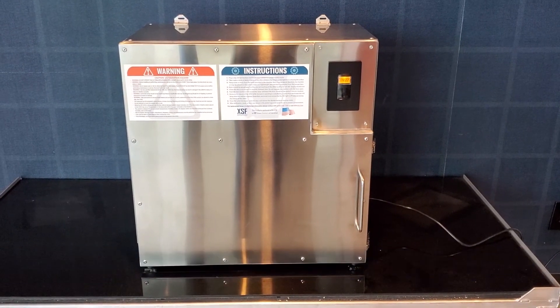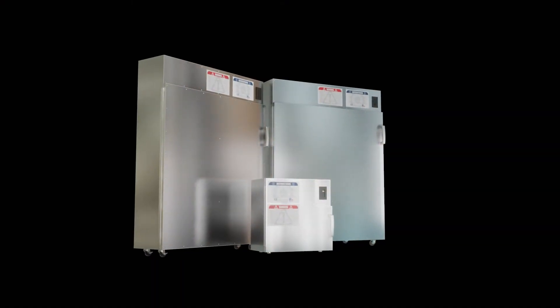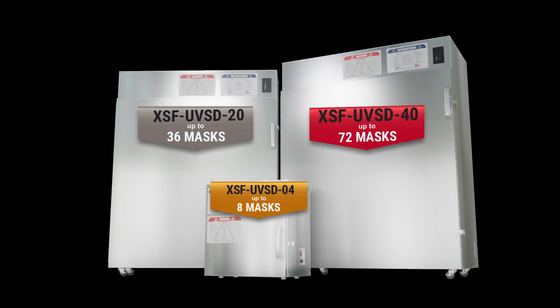The XSF sterilizer and disinfection cabinets are also available in two larger sizes. The UVSD20 can disinfect up to 36 masks or other items in a 5-minute cycle, and the UVSD40 can disinfect up to 72 masks or other items also in a 5-minute cycle.